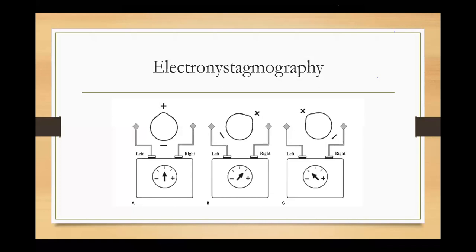What happens when the eye is turning towards your right side, which is trying to look towards the midline close to the nose? The electrode placed near the nose will record a positive response, because it is recording more positive when compared to the other side, the lateral one. You need two electrodes to record anything. We definitely need two electrodes to check the potential difference. With one we cannot say.